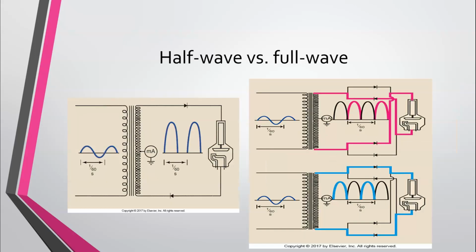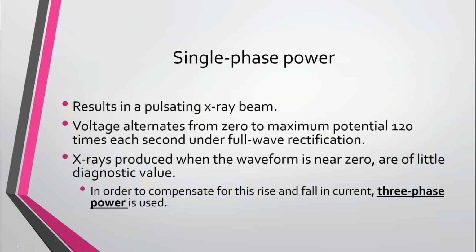So nice. As you can see here, this is a normal sine wave right there, and then we have rectified. This is with 2, so we're just flatlining right here. We're just turning off the negative portion. Then we use 4 diodes here, and we've got positive only, so we've cut out the negative side, so we have direct current, and you can see that it makes a big difference there. So we've reduced our exposure times by half.